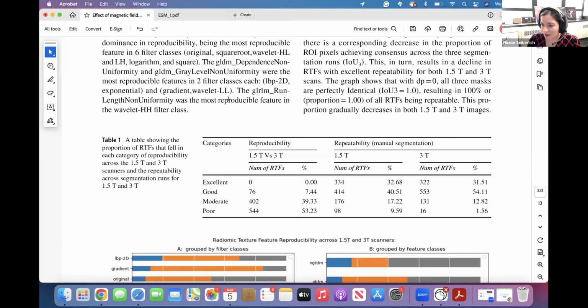A question from Matthias: is reproducibility mainly affected at the border zones of the contours, which seems to make sense? If so, would adding an offset, so eroding those segmentations and reducing pixels that contain blood and myocardium, help? Or I guess just reducing the ones that contain blood pool.